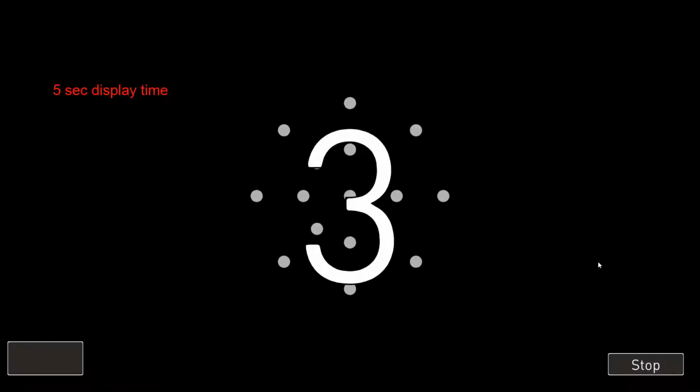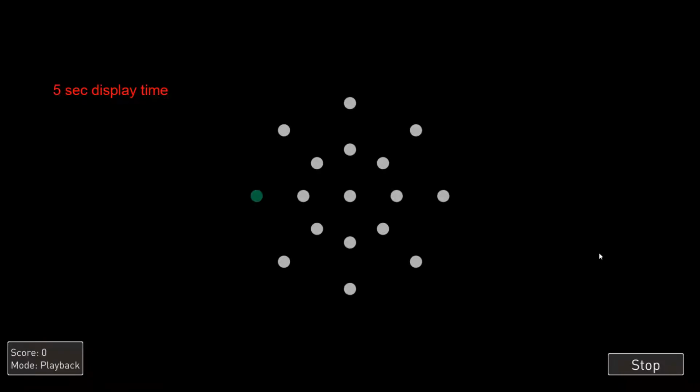And here again, it's going to be displaying 5 targets, just kind of simulating that for you. And as I said, it's almost painful to watch this. You actually want to try to help them, but it just gives them more opportunities to make errors, and it gets them stretching this out in very small increments. And again, we reinforce what the sequence would have been.